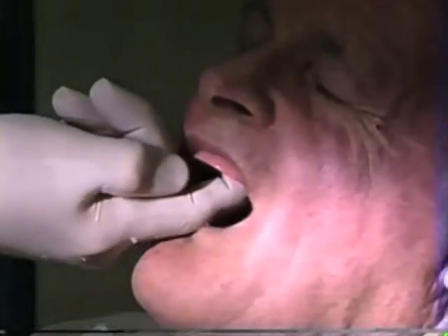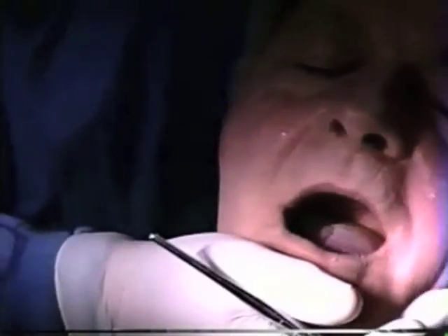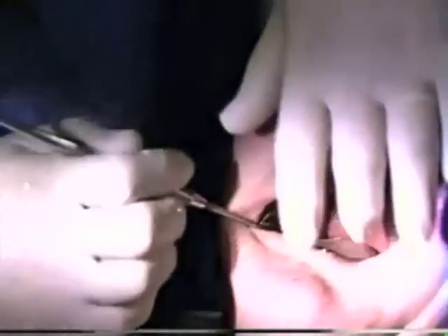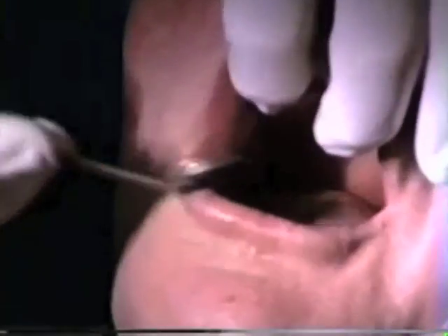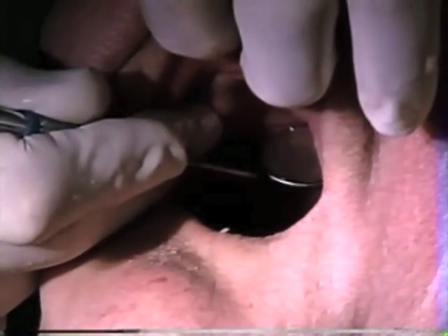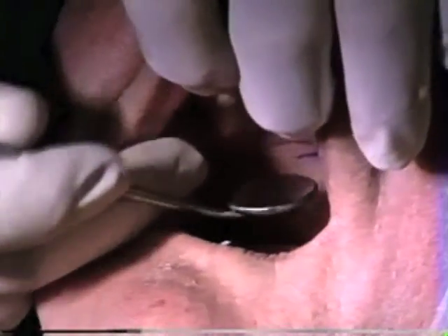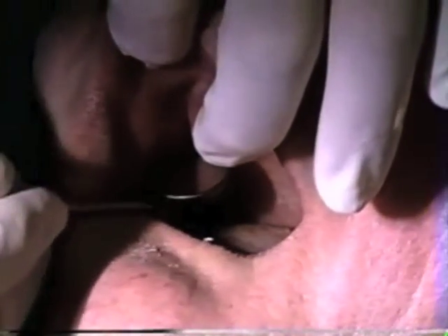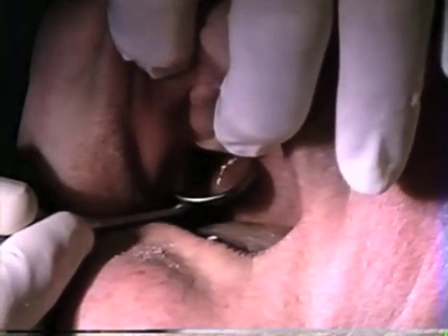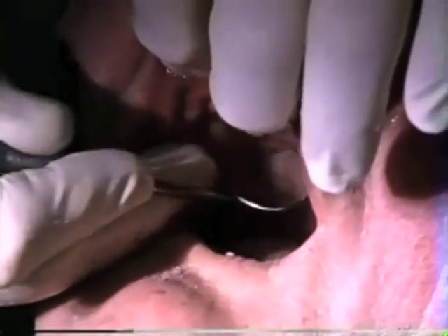Back in the mouth. Blow your nose real hard. Relax. We should see another mark now, anterior to the mark we had before. If we place this on the new mark and say ah, we see the soft palate does not move away from it now. Let's see if we come to the hamular notch — that mark should go right through the mirror head, and it does. On the other side, that mark should go right through the mirror head, and it does.